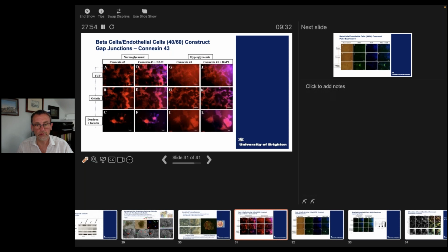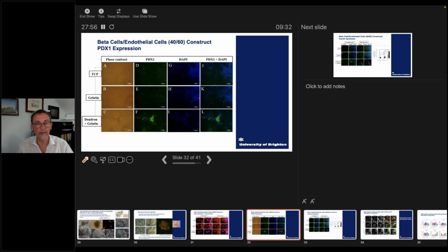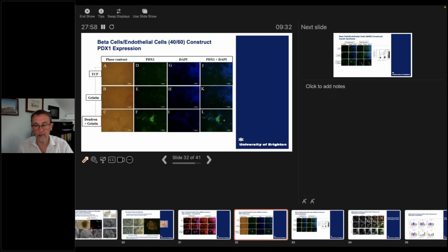But what is most of interest to you is that both the typical markers of expression of beta cells were highly expressed in PhenoDrive, and I would say that in this case, PhenoDrive was combined to gelatin as the main linear polymer to be functionalized.